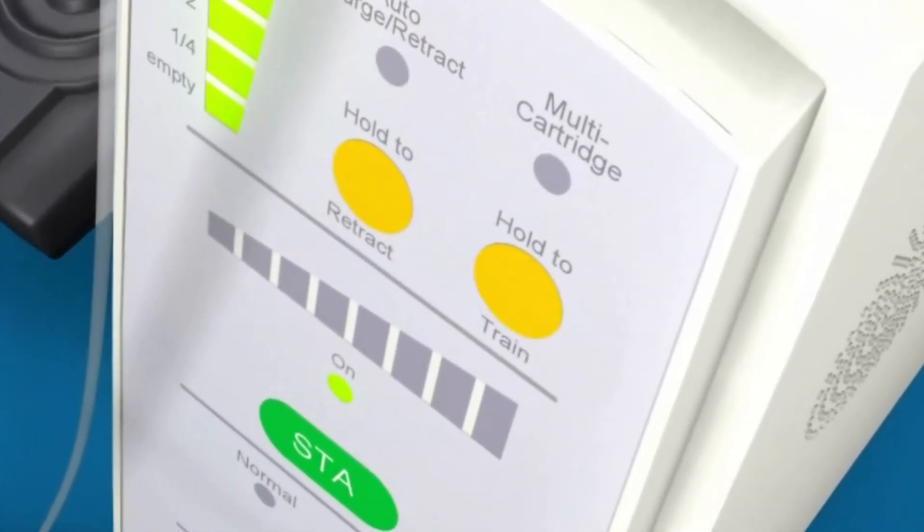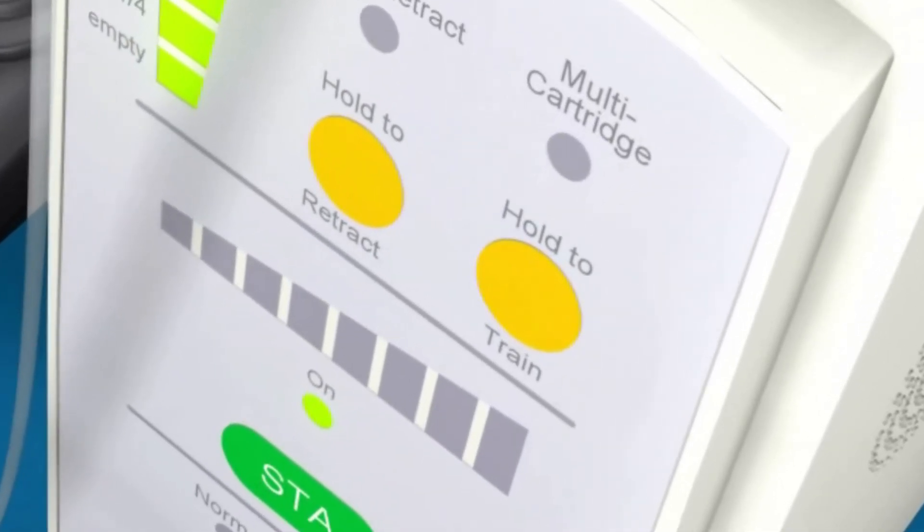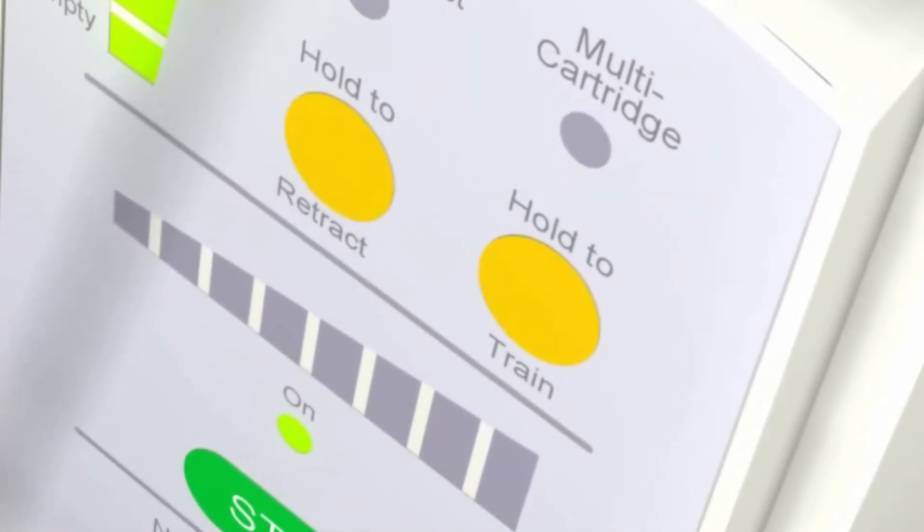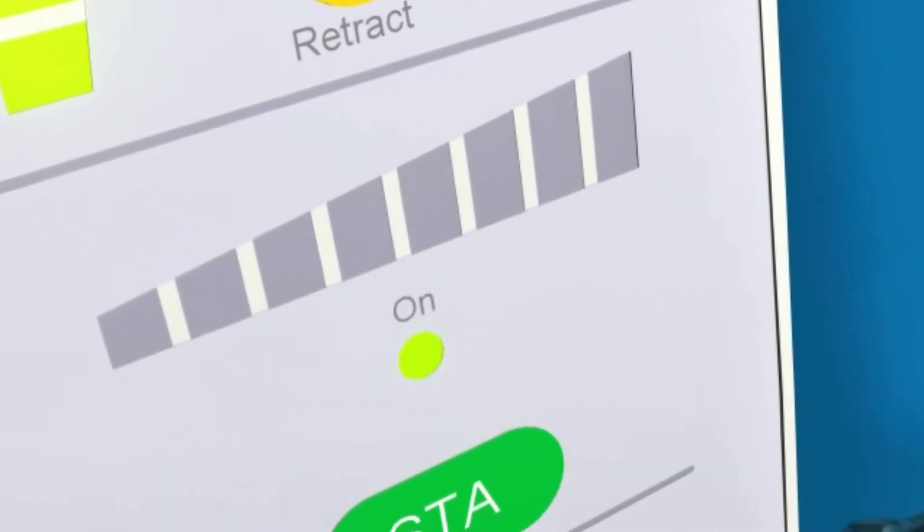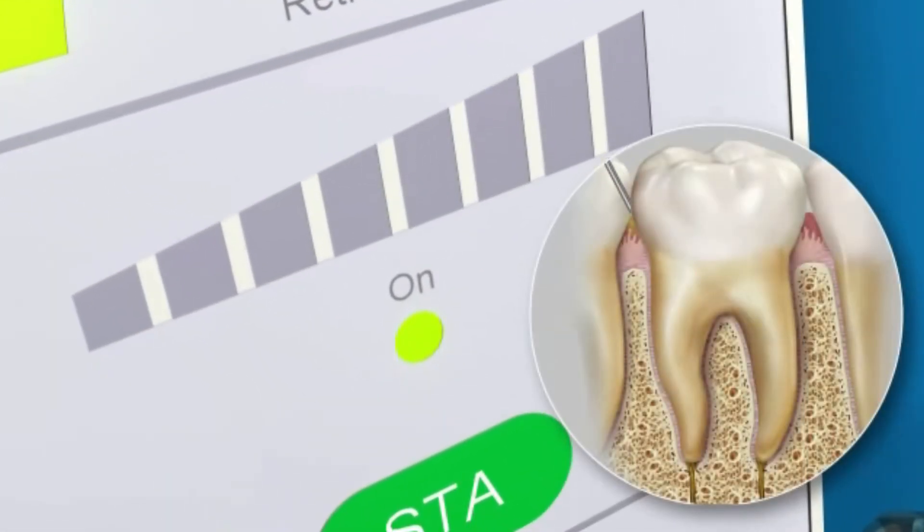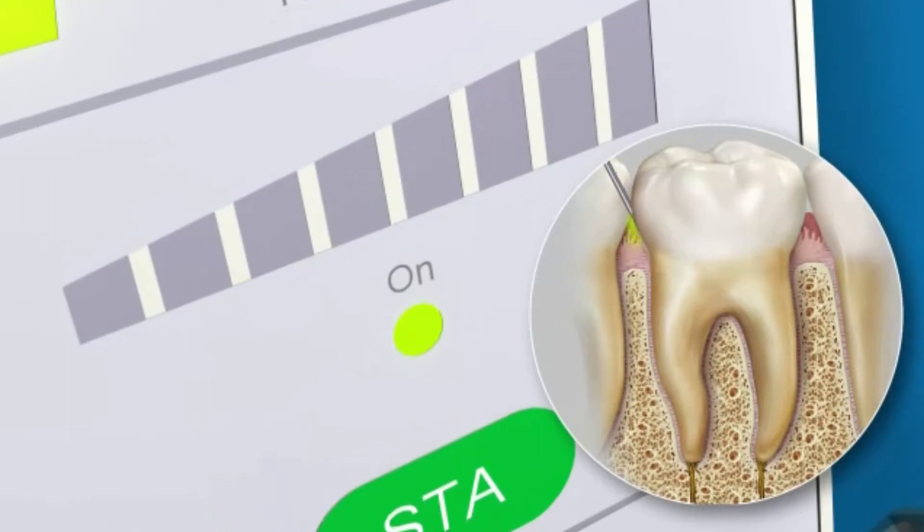This particular C-CLAD system incorporates an additional innovative development called dynamic pressure sensing technology, or DPS. This enables the practitioner to be guided and identify specific anatomical injection sites, such as identifying the PDL tissues when performing an intraligamentary or PDL injection.